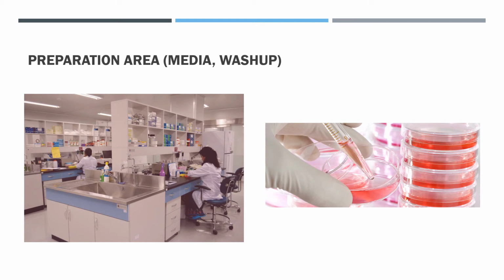Preparation area. In small labs, extensive media preparation can be avoided if there is a reliable source of commercial culture media. Although a large laboratory may still find it economical to prepare its own media, it is much more convenient to purchase ready-made culture media for smaller labs. All the items required for media preparation are to be sterilized.